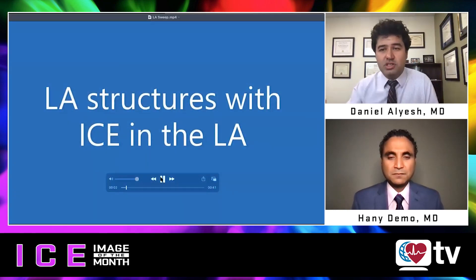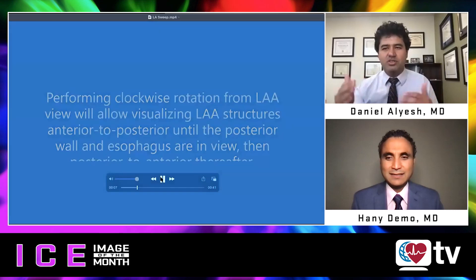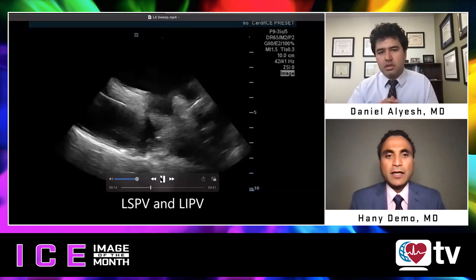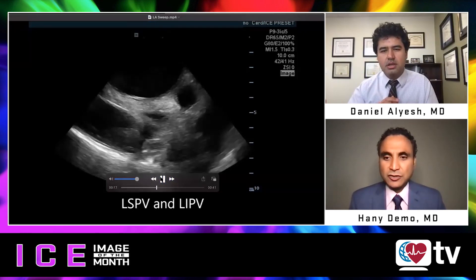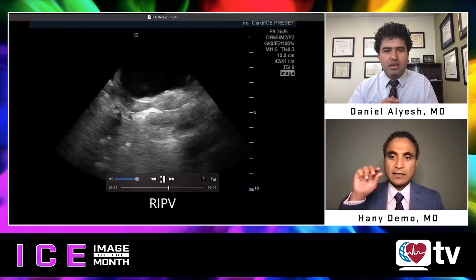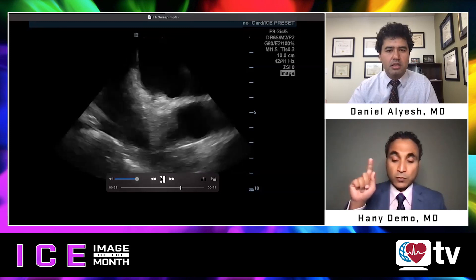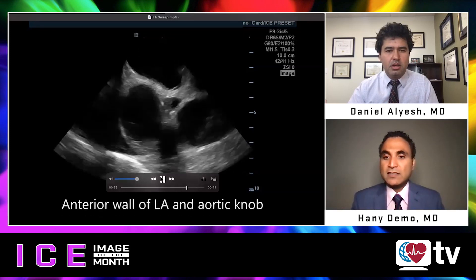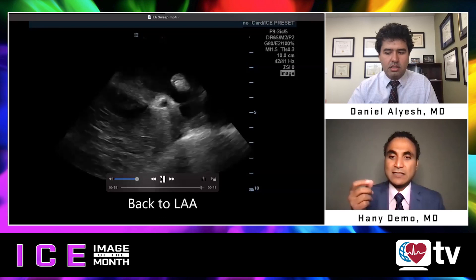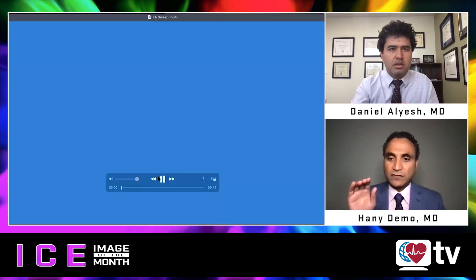Our next image is a nice sweep of the left atrial structures. Dr. Demo, can you talk us through manipulating the catheter — what are you looking at and all the different landmarks? Once the ICE catheter is in the left atrium, I perform very similar maneuvers to when ICE is in the right atrium — basically small clockwise rotations taking us through different structures. The only difference is you don't have a thick interatrial septum in view, and intracardiac devices or leads are not in the picture, so it's just a clear view of the left atrial structures.